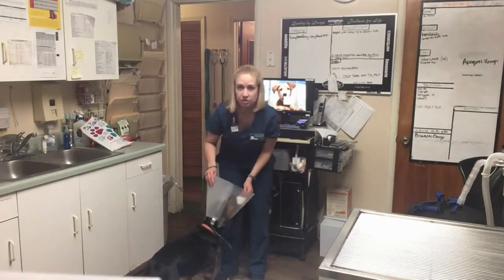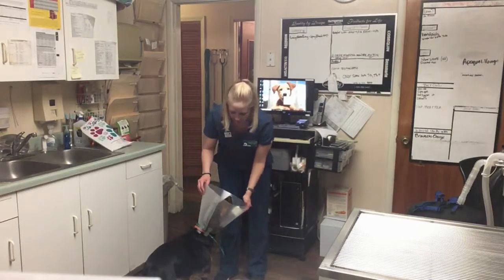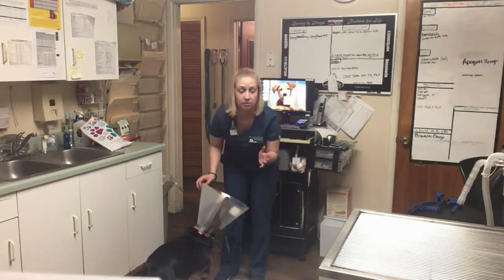But you do want to make sure and test to make sure it is not going to be easily pulled over his head, just in case he's going to try and pull it off, as they don't like it. Make sure he's not going to be able to pull it off himself.